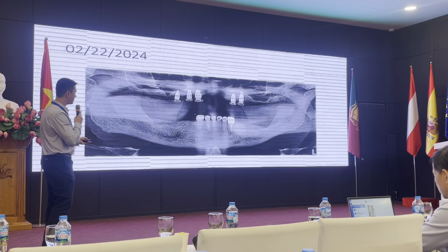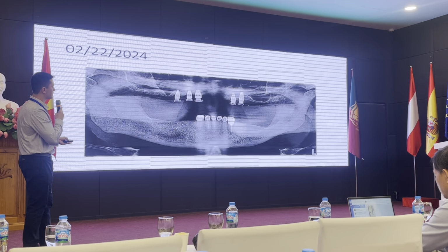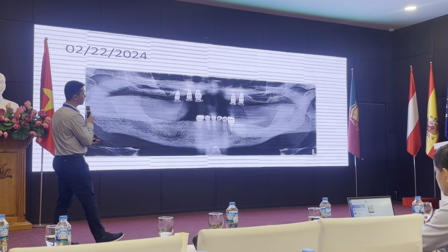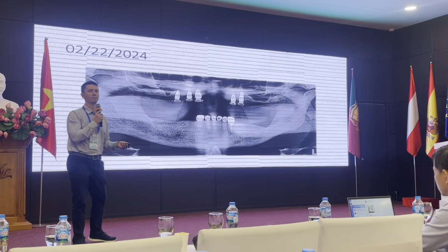He wants the same type of restoration that he has for the top, where these are locator abutments, and he's wearing a denture, so they're going to be able to click into the implants. So they're still removable, but they have implant anchorage support.